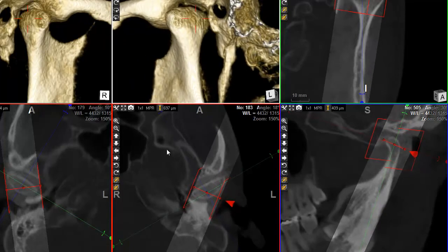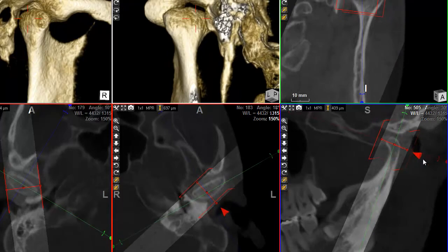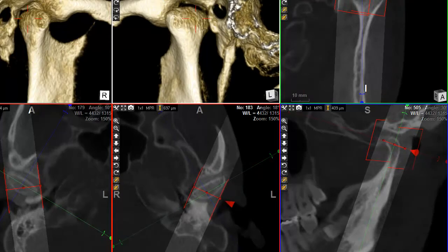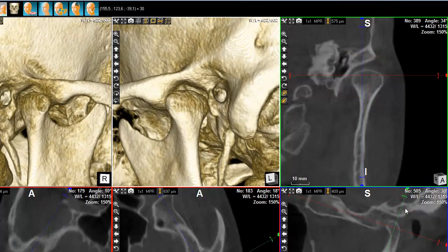with the mouse in 3D, but it is very easy to get lost. So in general, I would recommend to simply use this one. You can do it in all dimensions in 3D, and that's in general much clearer, and you get a very good idea of your position. If you start modifying here, your image or your capacity of diagnostic is of course reduced. If I still want to see my 2D images in a clear way, simply unclick here, and there you go. As you can see, before and after.